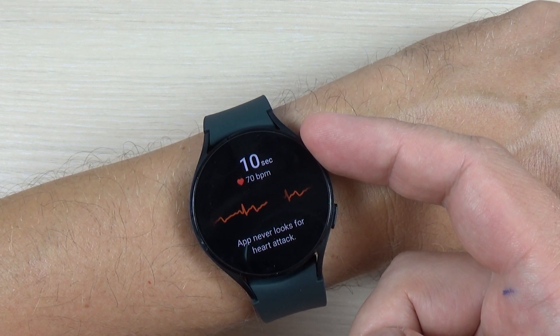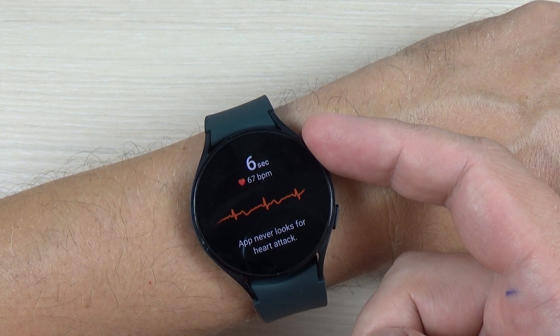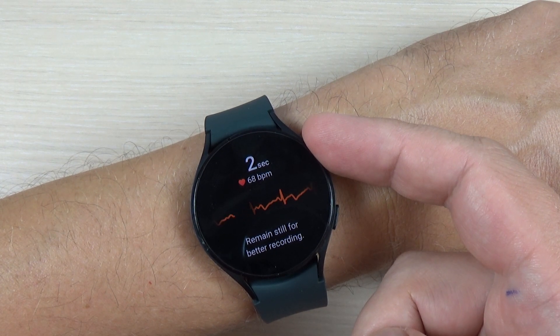Just 10 seconds left — 9, 8, 7, 6, 5, 4, 3, 2, 1.